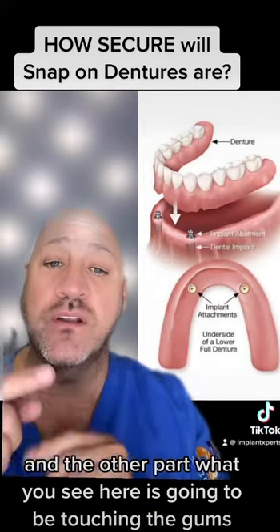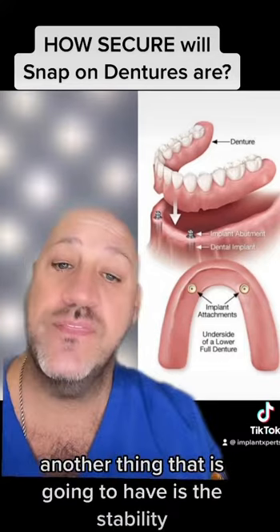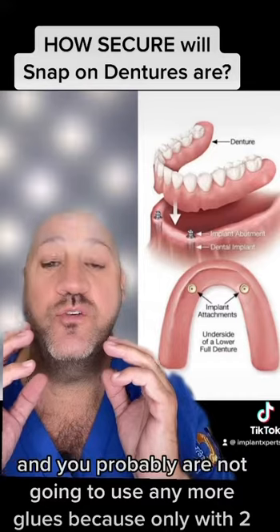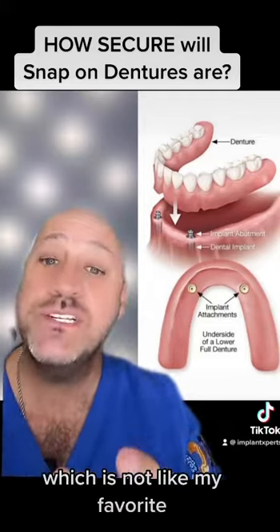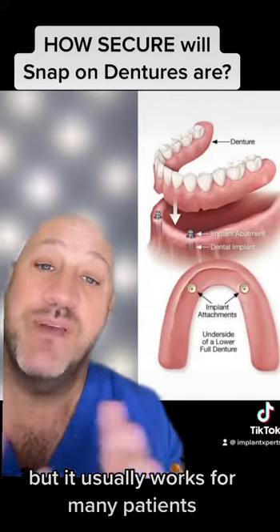The other part, what you see here, is going to be touching the gums. Another benefit is stability — it will have more stability and you probably won't need to use any more glues. With just two implants it's going to be supported, which is not my favorite, but it usually works for many patients.